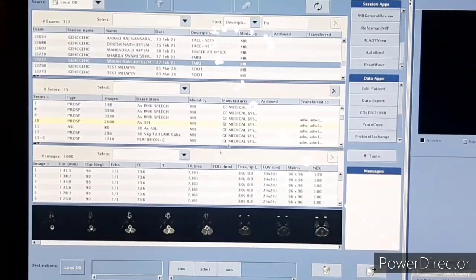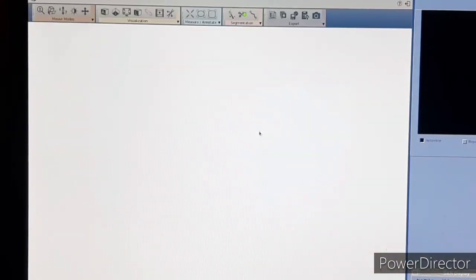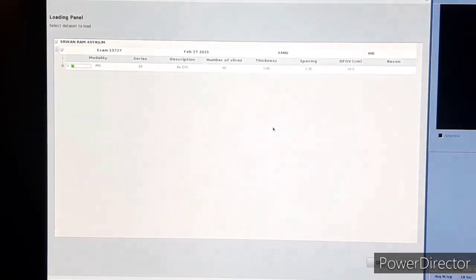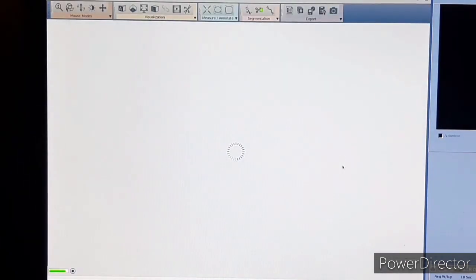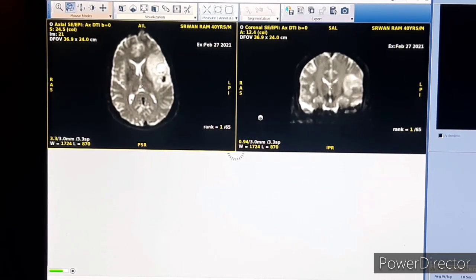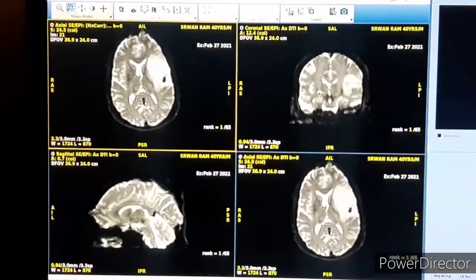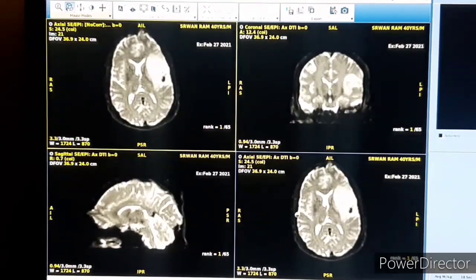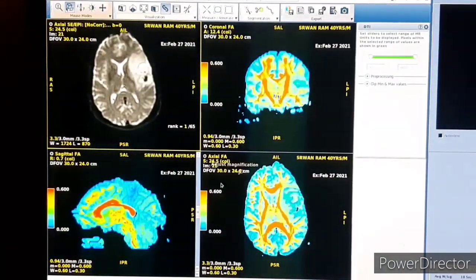To do DTI tractography, first we will open the DTI sequence in the Ready View. You can see it is open in the Ready View, and you can see the three planes of the DTI sequence.